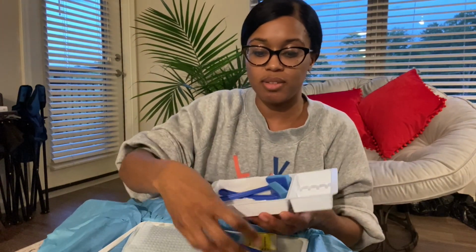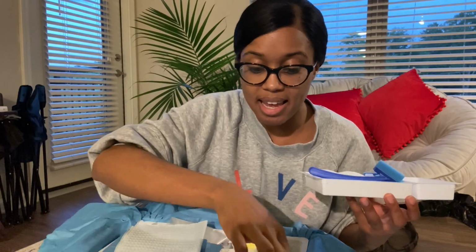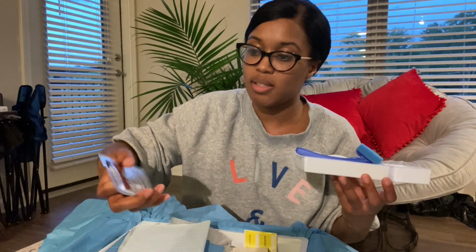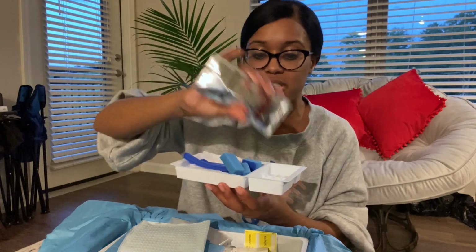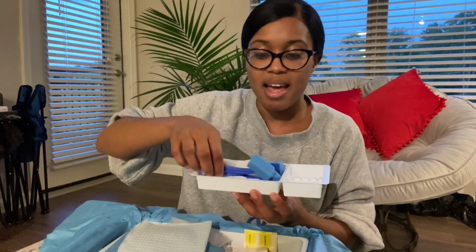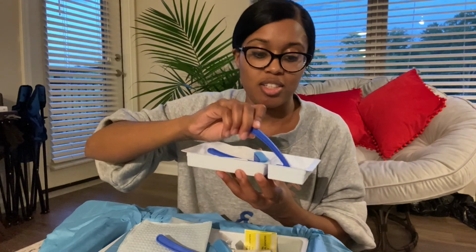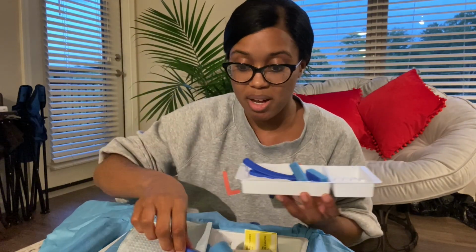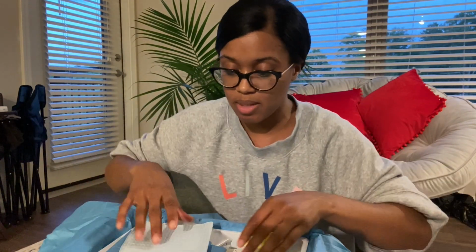Okay, so inside the kit, first we have these sponges, and then also some iodine. And we use this just to clean off the patient's back really well. So we dump this in here and really scrub the patient's back, to decrease the risk of infection. Okay, so that's that. What else do we have in here?